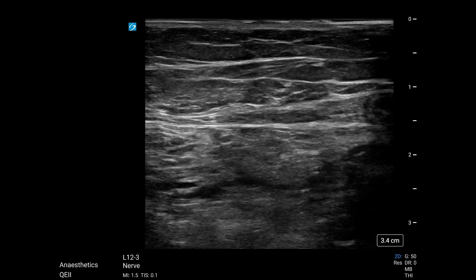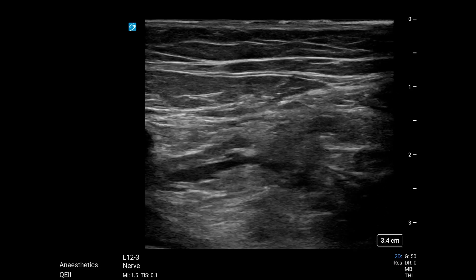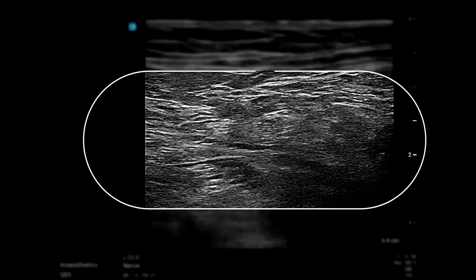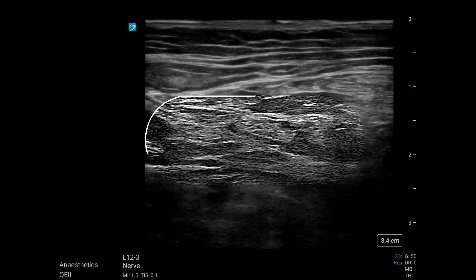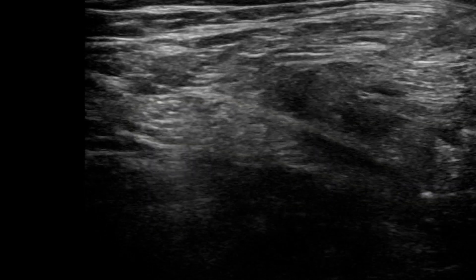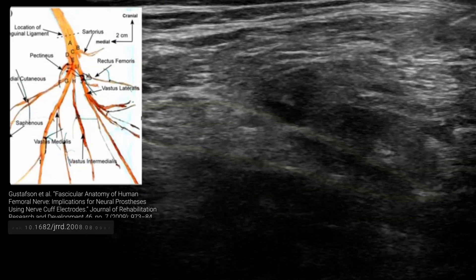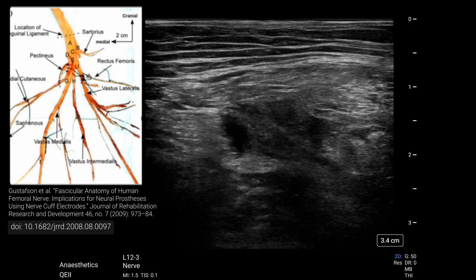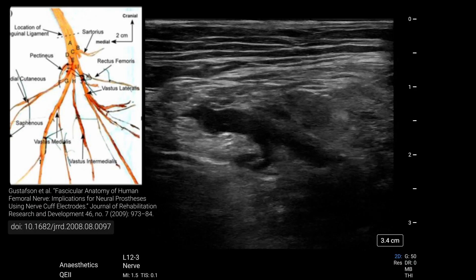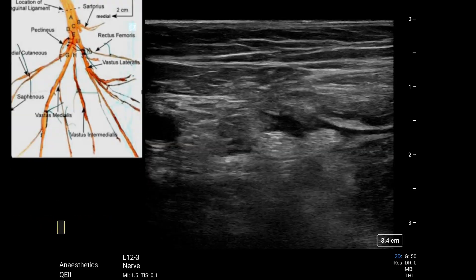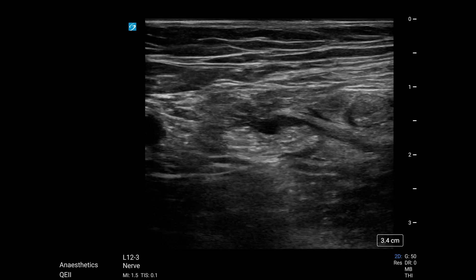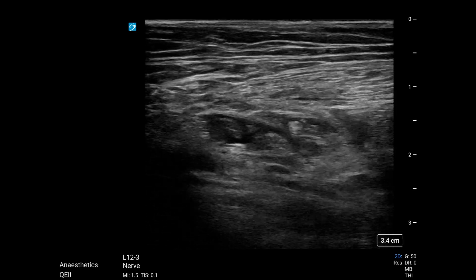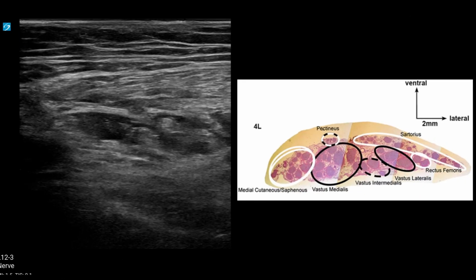This is where we could have caused a nerve injury. What we're looking at now is post-injection scanning, and what we see here is the actual femoral nerve — it's much more superficial than we had appreciated. At this level the femoral nerve has started to arborize, branching out into the more peripheral branches of the nerve. We're going to pop under what is actually the fascia iliaca and put a little bit more local in there, and once that has time to spread out, it'll make the femoral nerve a lot more obvious, and interestingly some of the terminal branches are obvious as well.